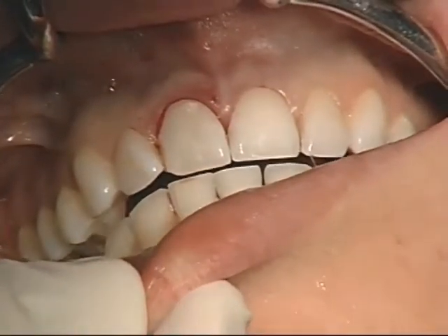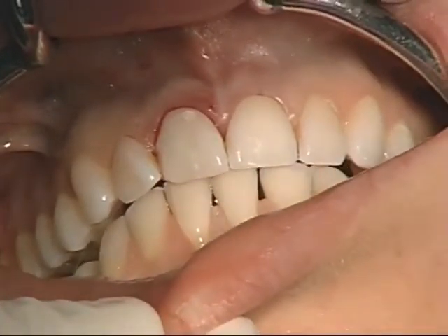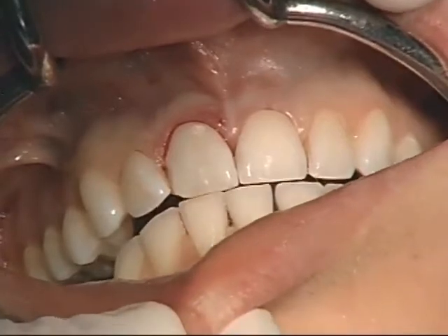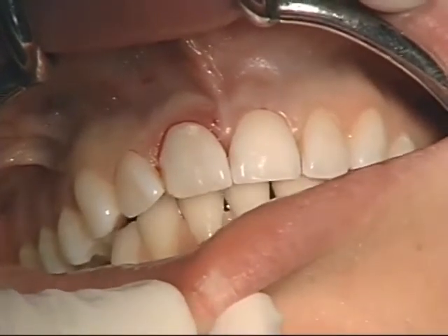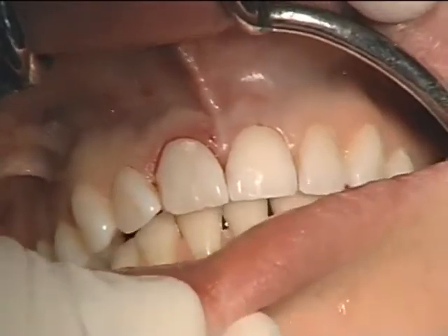Checking of the occlusion now, as this is an immediate non-functional restoration, free of occlusion in centric relation and protrusive. Any reduction to the incisal edge or to the lingual aspect of the tooth itself would be accomplished at this point.